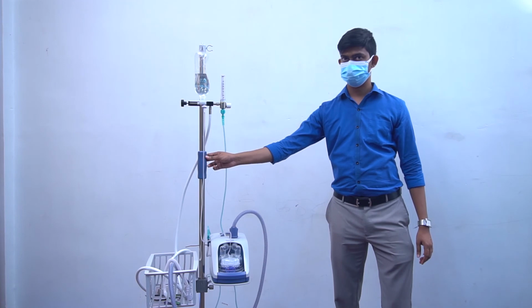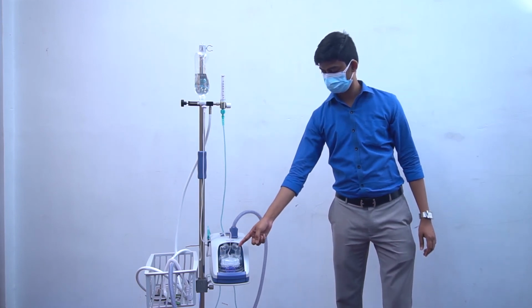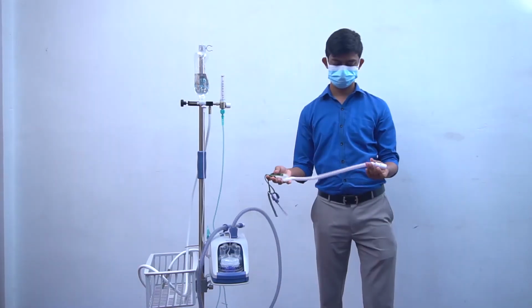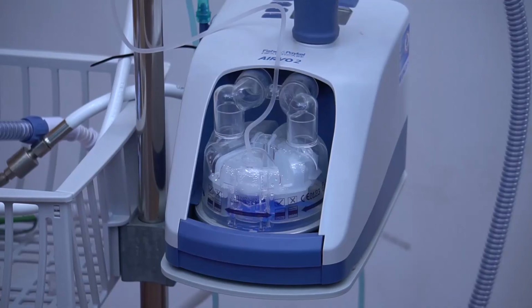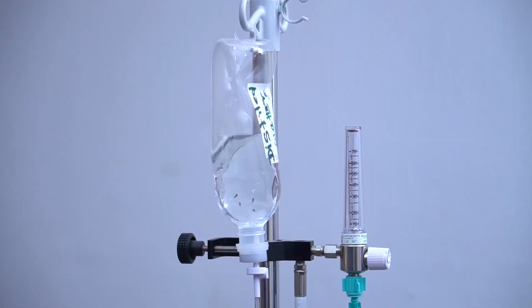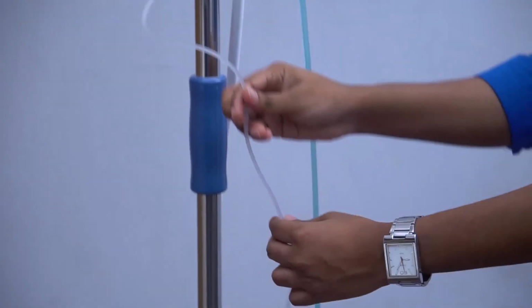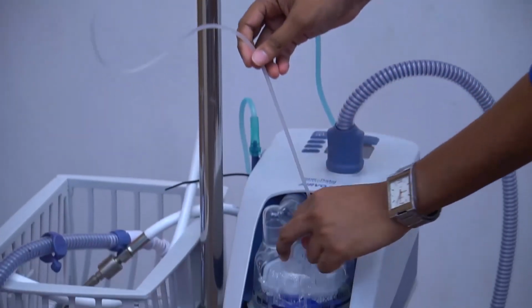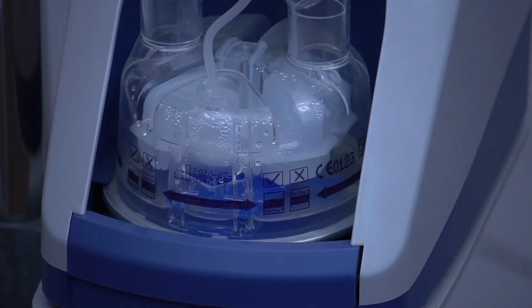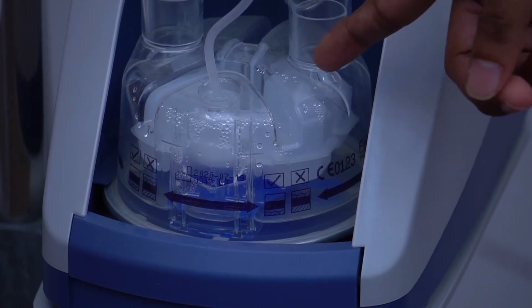The high flow machine contains the main body, humidifier, oxygen supply, and tubing system including nasal cannula. The humidifier is located here in this machine. A sterile water bag should be connected to the humidifier before starting high flow ventilation. This humidifier can control the water level by using the floater inside the humidifier.